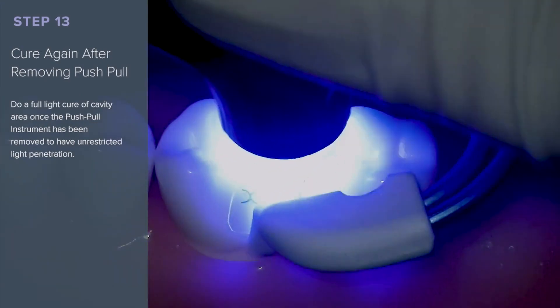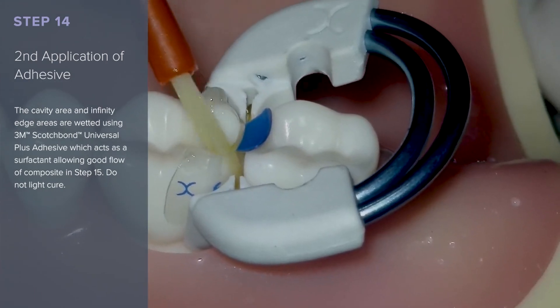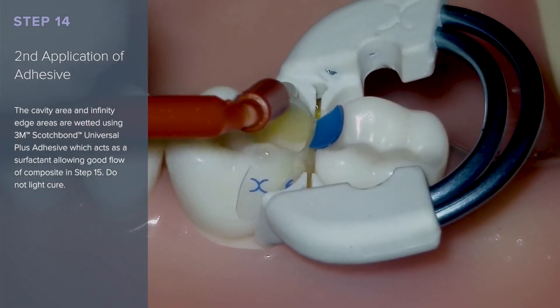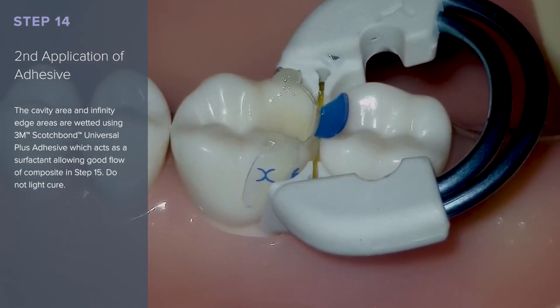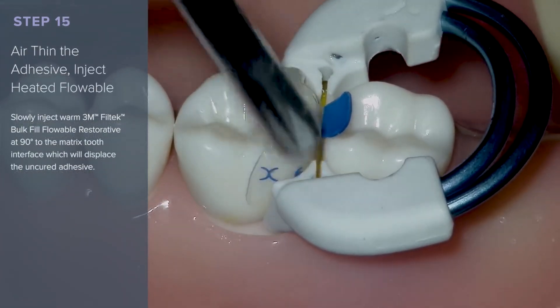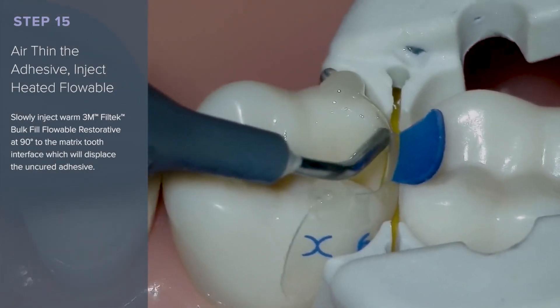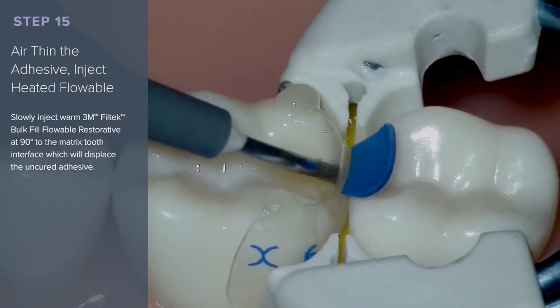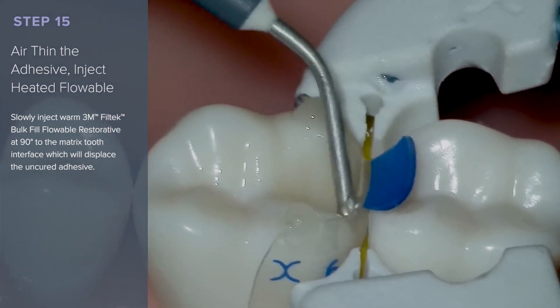Cure again after removing the push-pull instrument. For the second application of adhesive, the cavity area and infinity edge areas are wetted using 3M Scotchbond Universal Plus adhesive as a surfactant, allowing good flow of composite. Air-thin the adhesive, then inject heated flowable. Slowly inject the warm 3M Filtek Bulk Fill Flowable Restorative at 90 degrees to the matrix-tooth interface, which will displace the uncured adhesive.